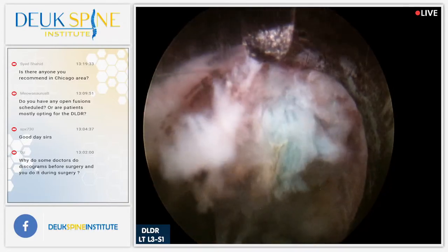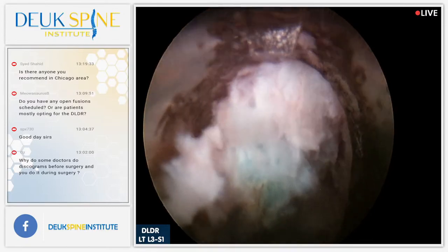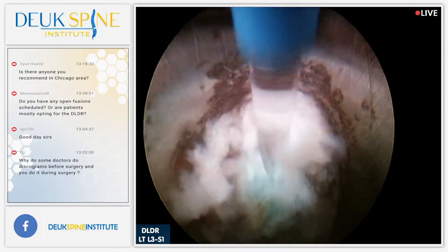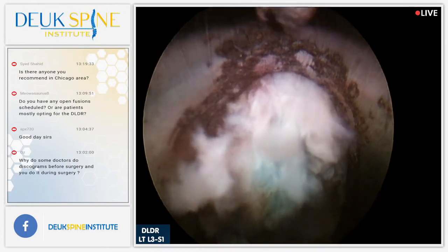Look at the tear right there. So, Henry, there's some inflammatory tissue here. You could see it. It's that pinkish color. I don't know if it's good enough to put in our paper. What do you think, Henry? Probably not, right?